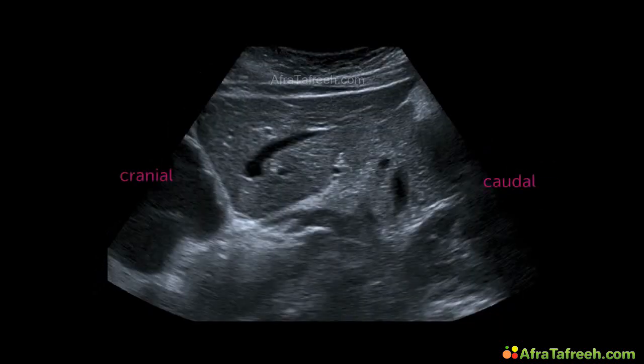So here the next view, longitudinal epigastric view, when we come to the right side of the patient. So we see the left liver lobe is a little bit larger. Again, cranial is over here, is the diaphragm. And some parts of the heart we can see, that's true. Okay, let's get on to the next picture.